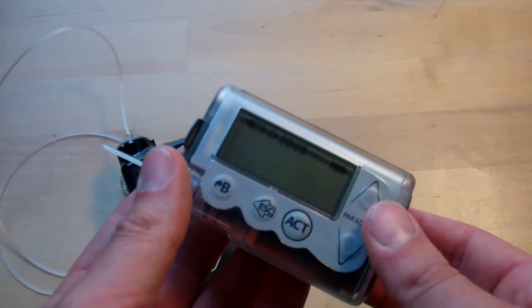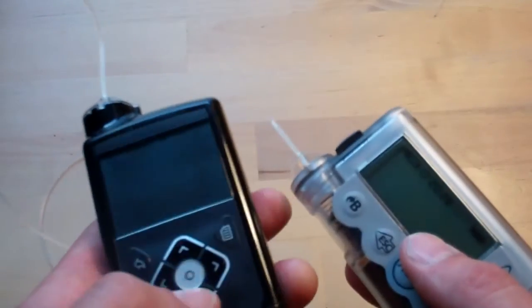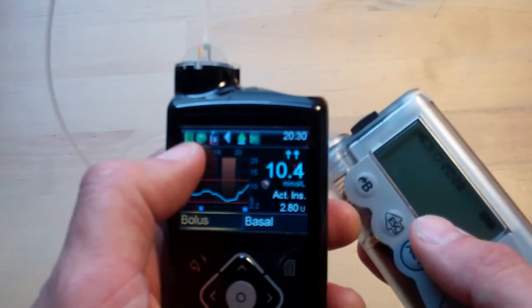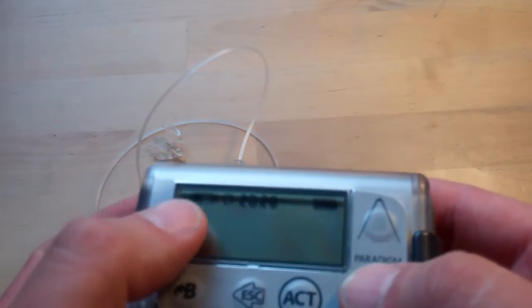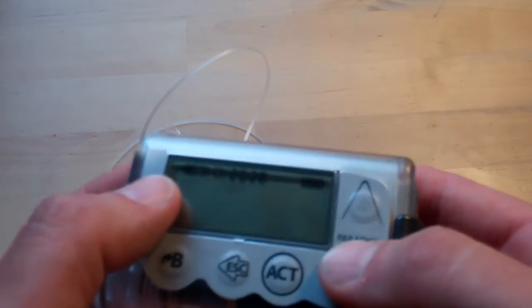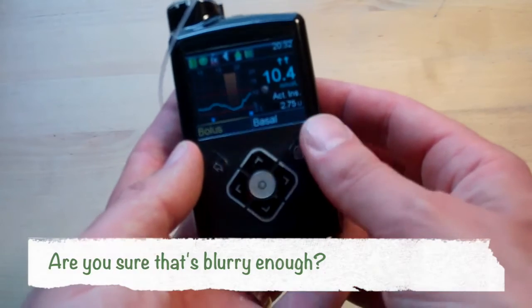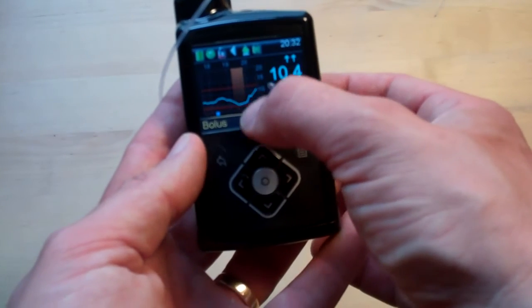One benefit the 640G does have over the Veo is the battery indicator. Up here on the 640G it's a little colour-coded top bar of icons — green for all good, then it goes through amber and into red. With the Veo, because it only had three or four segments in its battery indicator, it would go down to one, back up to two, back down to one, and you'd never really know if it was on its last legs. With the 640G, at least you know when it's nearly time for a change. I was down to nearly five and had a swig of Lucozade, with the SmartGuard — the orange bar — kicking in. Much more about that to come later.